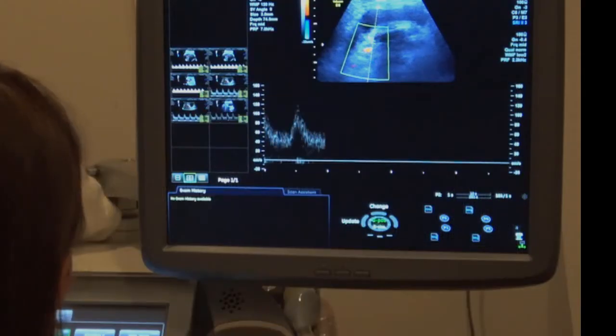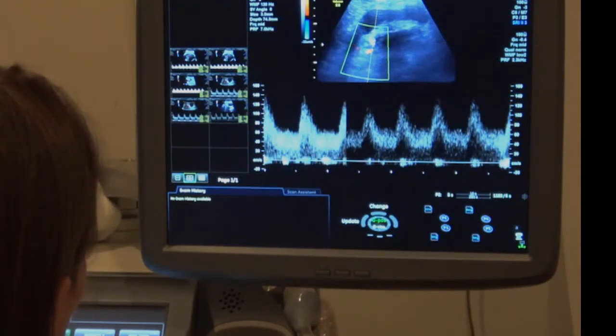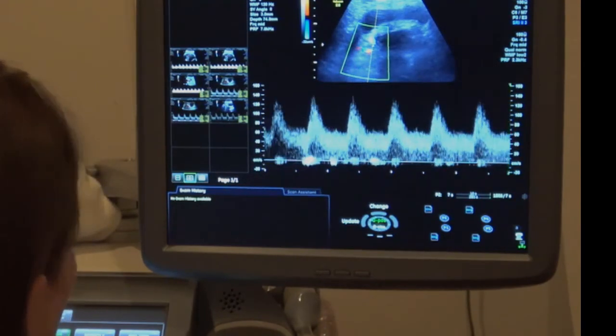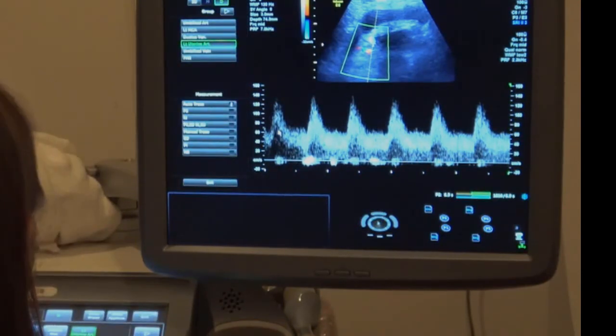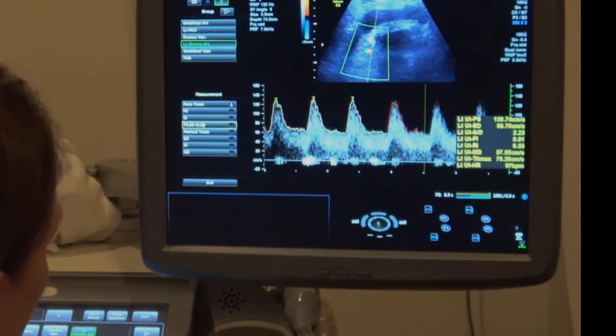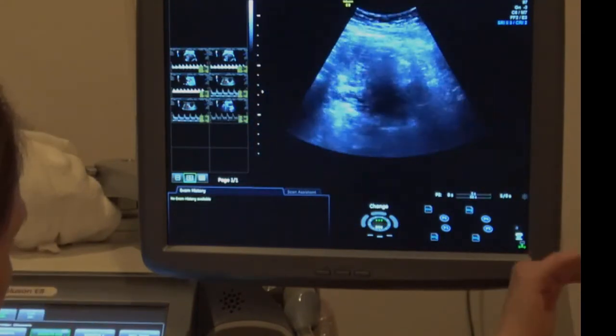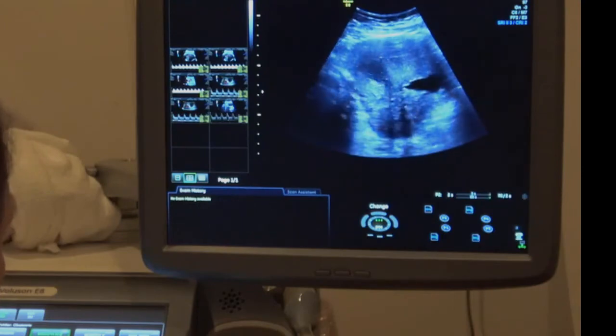As you grow a placenta, your spiral arteries are going to enlarge, and the distal vascular bed, which is the placenta, is like a big sponge. Low resistance. Because there are so many new vessels growing, the resistance will drop. So instead of the diastolic flow looking so close to the zero line, it's going to elevate and look more and more like your ICA to your brain.